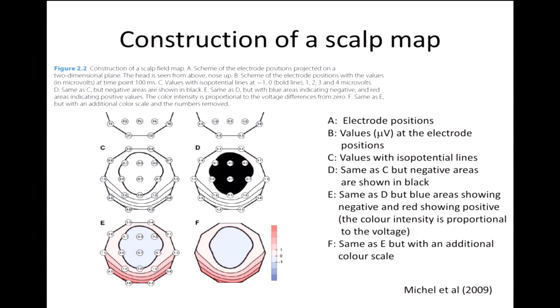So that's the very first topographical analysis of the EEG signal.